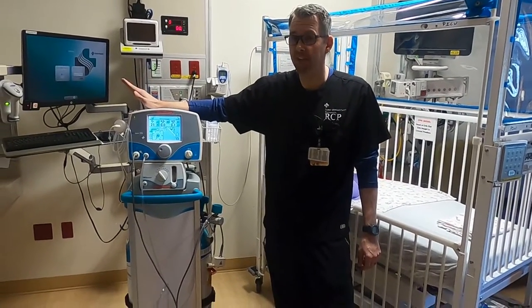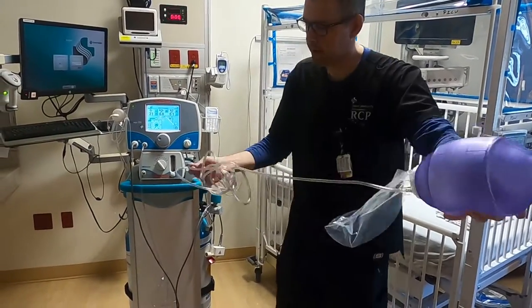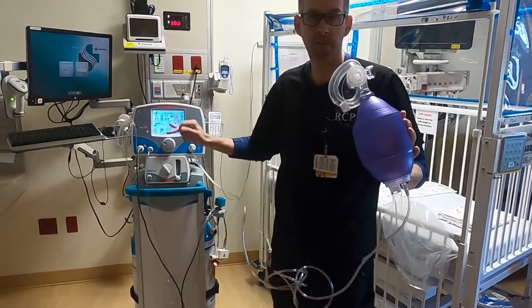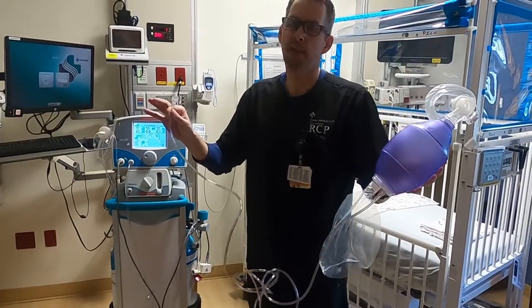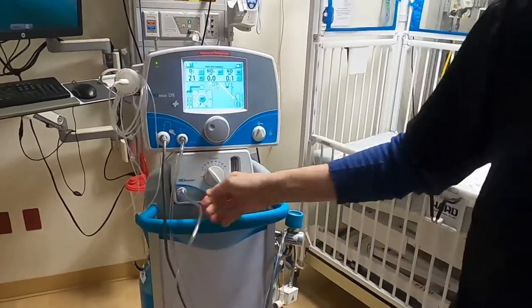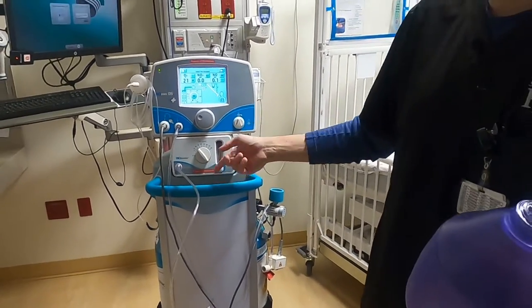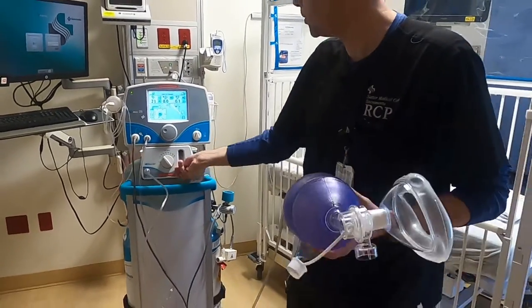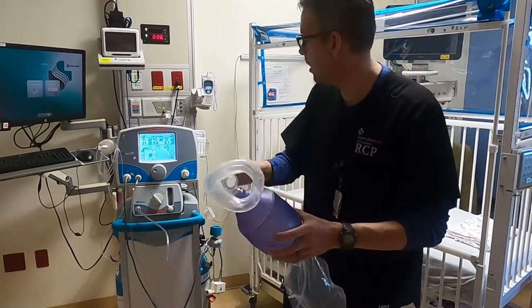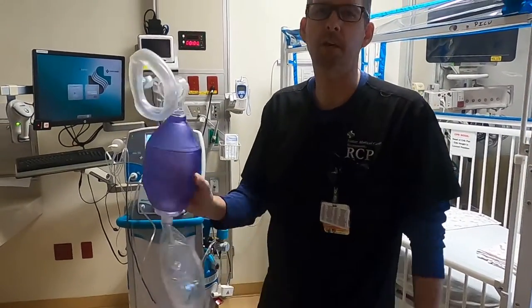If you have to manually ventilate your patient while they're on INO, you can do that. When the patient is on nitric oxide, the Ambu bag is connected to the blender system instead of to the wall, so that if an emergency happens and you have to bag the patient, you can still give them nitric oxide. Set your parts per million to whatever they're currently on. Flow is dependent on patient size — for an adult, 12 to 15 liters per minute. Then disconnect and bag away. They'll receive 100% FiO2 or as close to it as possible with whatever parts per million you have set.